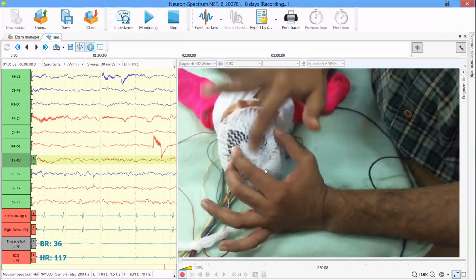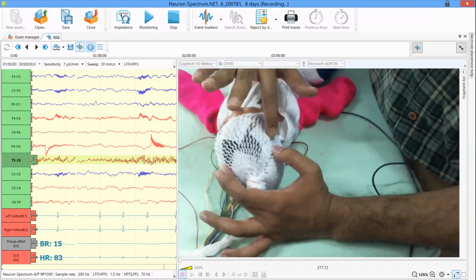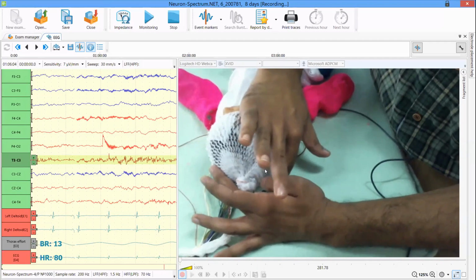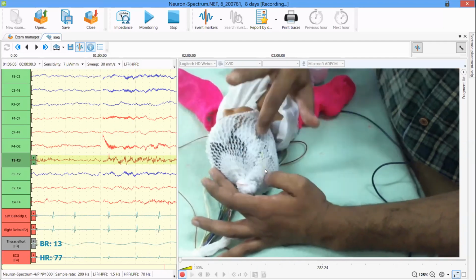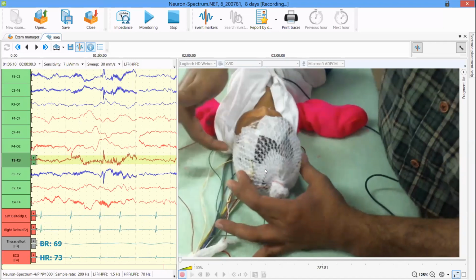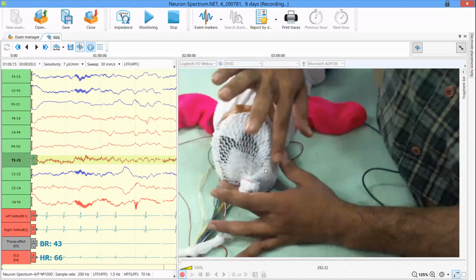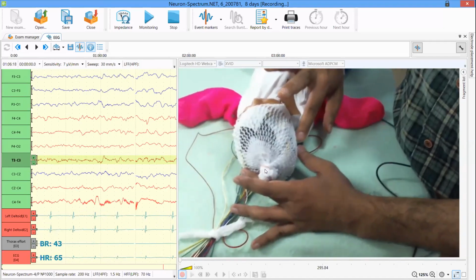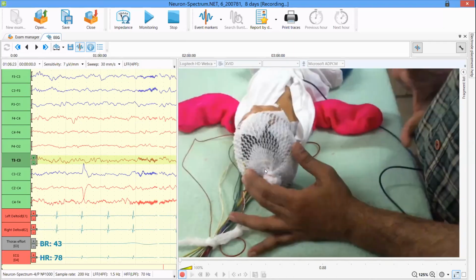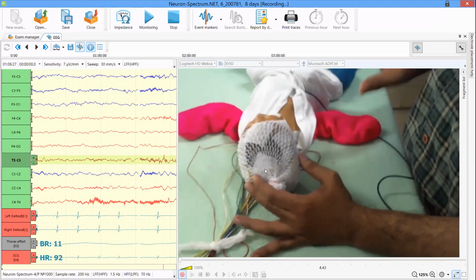and for the parasagittal electrodes, we should make sure F4, C4, P4 and O2 are in a curvilinear line. And the transverse ones also, we have to make sure T3, C3, CZ, C4 and T4 are in a line and equidistant. Basically, this is the most important one. We have to get the impedance right, and we need to make sure that electrodes are equidistant and symmetrical. That's from my side.